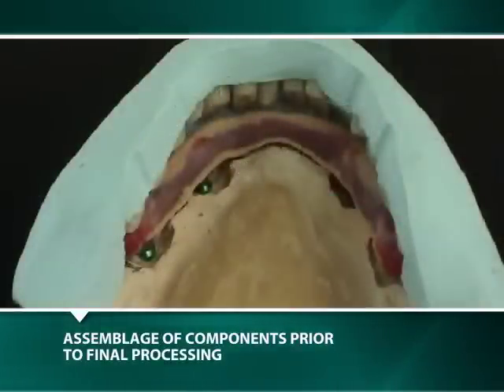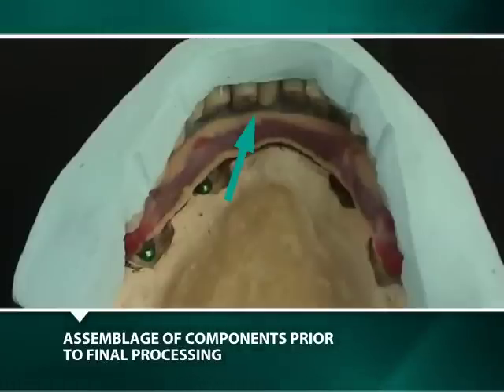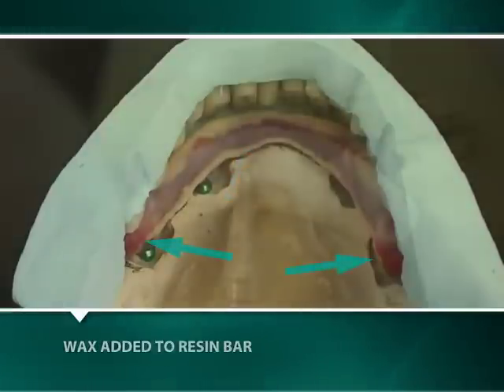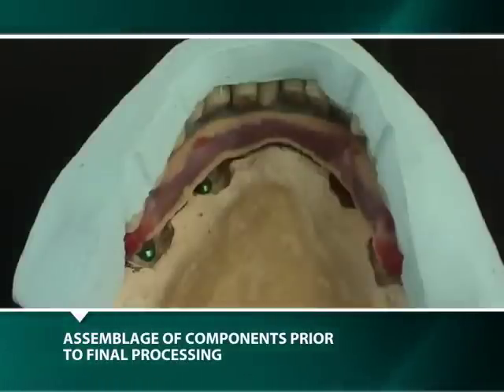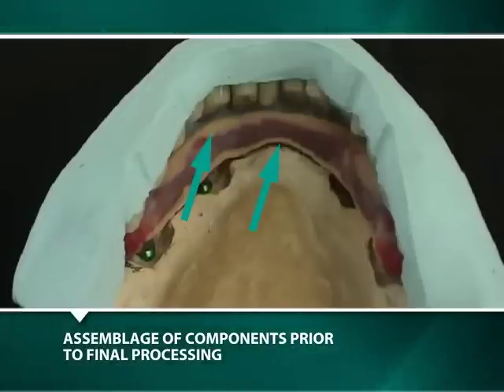The facial occlusal mask and the resin bar are then repositioned on the model to confirm the appropriateness of their contours relative to each other and particularly to the cervical gingival area of the intended teeth. If necessary, the resin bar may be modified by adding wax or by reducing it with a burr. Prior to its being sprayed and digitally scanned, the space between the resin bar and the ridge area between the pencil lines on the model is filled with a putty material so that the milled framework will be in contact with the soft tissue of the edentulous ridge.